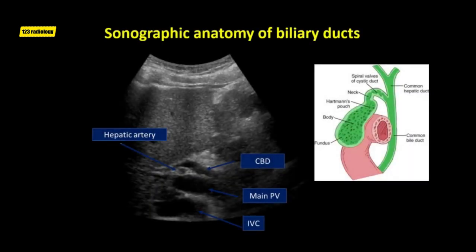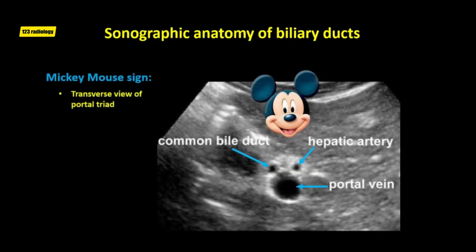The right and left hepatic ducts join to form the common hepatic duct, which is located anterior to the right and main portal veins. The distal cystic duct joins the common hepatic duct posteriorly to form the common bile duct. On longitudinal view, the proximal common bile duct at the porta hepatis courses anterior to the main portal vein and right hepatic artery. On transverse view, this portal triad has been described as the 'Mickey Mouse sign,' where the portal vein is Mickey's face, the common bile duct is the right ear, and the hepatic artery is the left ear.